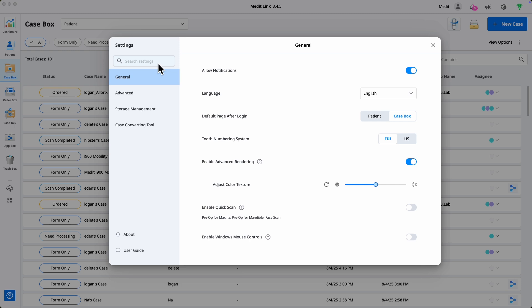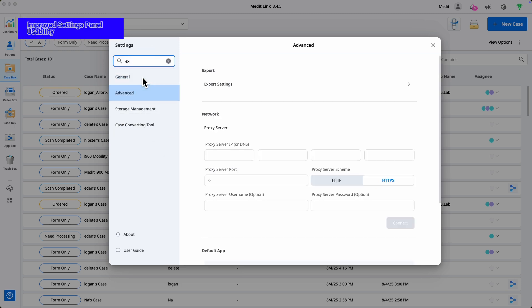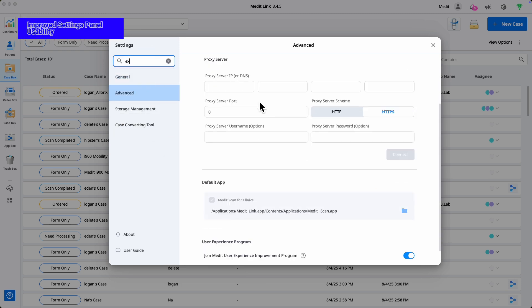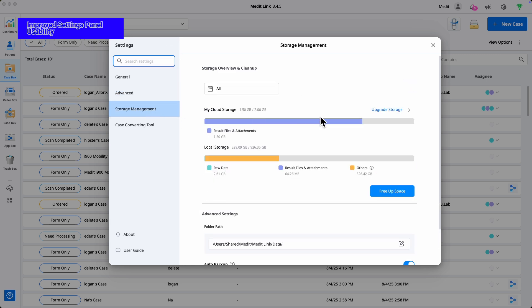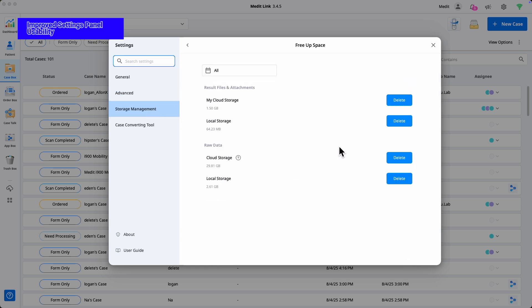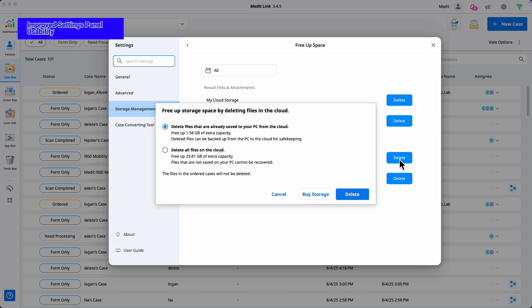The settings window now features a more intuitive UI. Quickly find what you need with the search function and see your changes applied instantly without clicking a save button. The redesigned storage management screen lets you view usage at a glance and organize your data with ease.